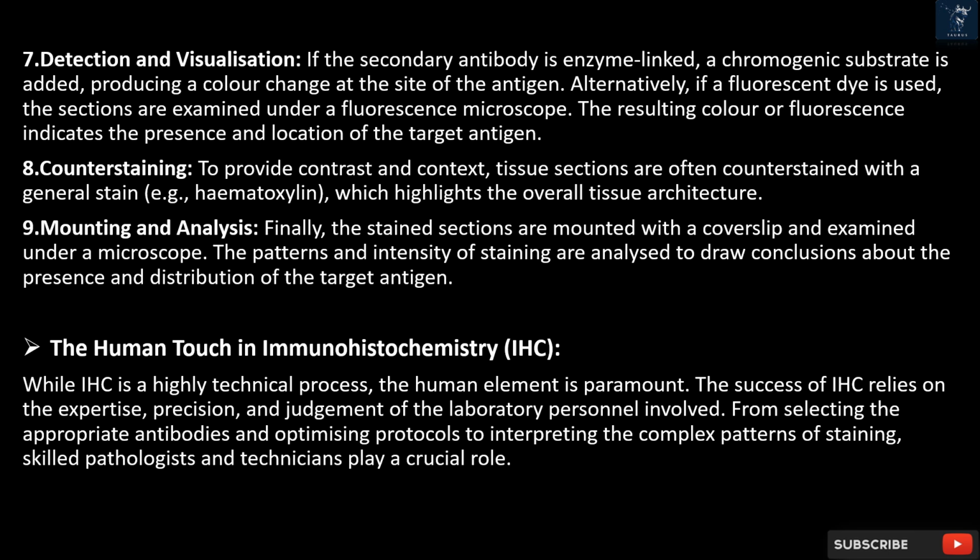The human touch in immunohistochemistry IHC. While IHC is a highly technical process, the human element is paramount. The success of IHC relies on the expertise, precision, and judgment of the laboratory personnel involved. From selecting the appropriate antibodies and optimizing protocols to interpreting the complex patterns of staining, skilled pathologists and technicians play a crucial role.